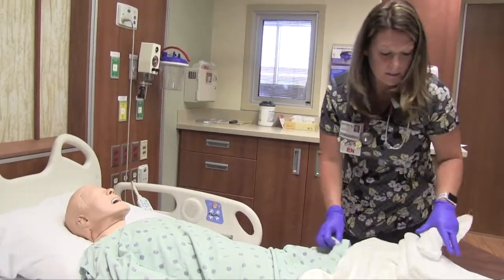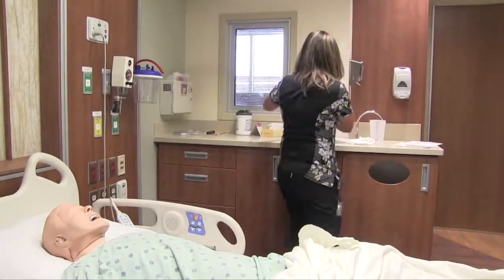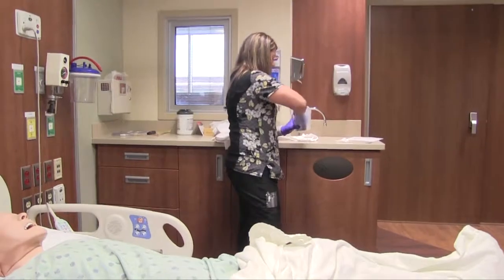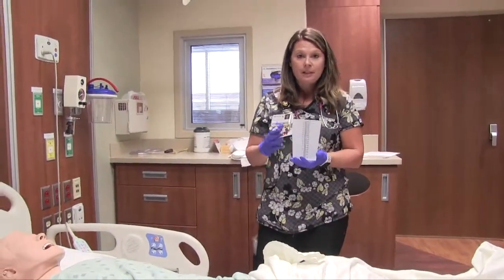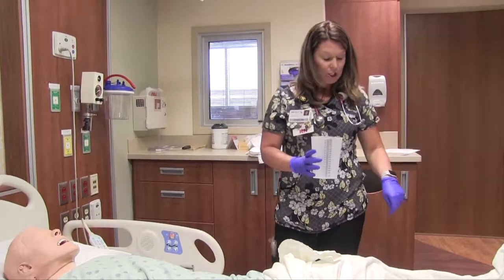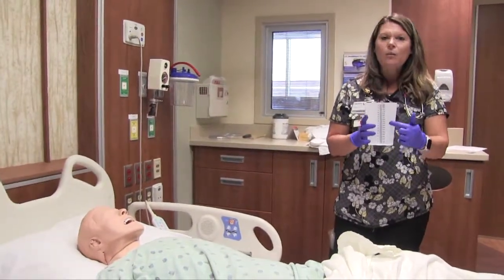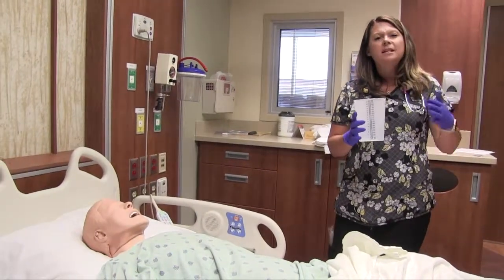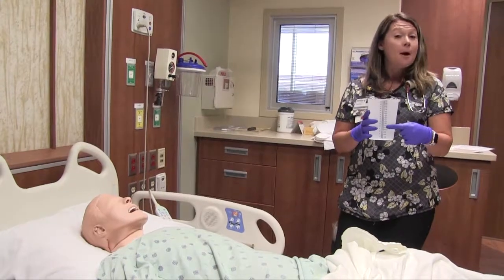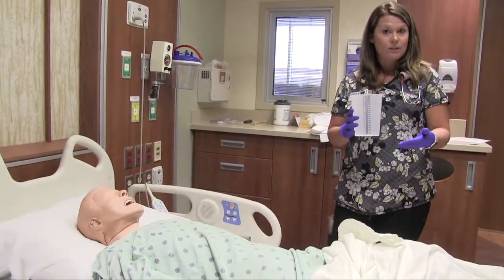Okay. I'm also going to send you home with this container. This is a container that you can use to empty your urine in. Once you're done, you empty your urine, you kind of get an idea of where you're at. You don't have to measure exactly, but if you're emptying so often, you kind of get to notice how much is coming out. If that drastically changes, you need to get a hold of your doctor.